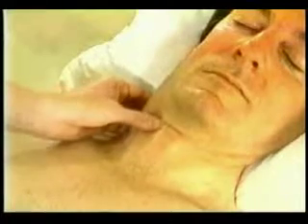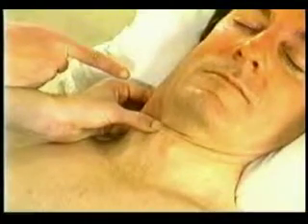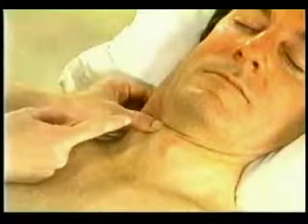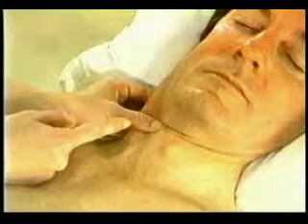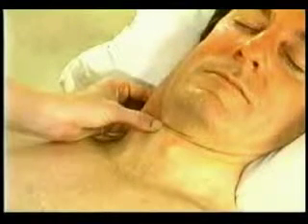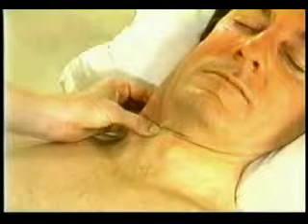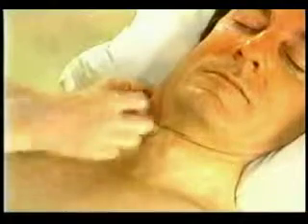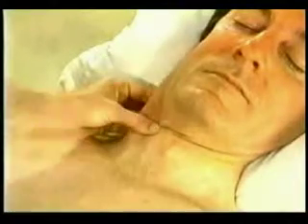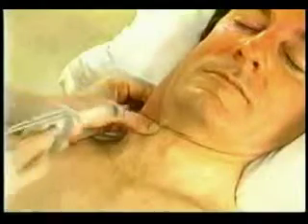Instead, the lump should be held by grabbing around the muscle, allowing the fingers to support it in the back, and the thumb to palpate it directly through the skin in front. Then, without loosening the grip, the thumb is allowed to slide down slightly, stretching the skin over the target. The skin is cleansed, and the needle is entered for sampling.